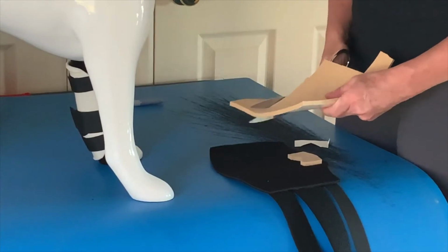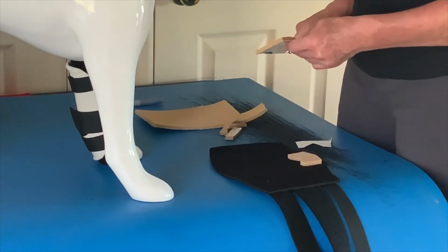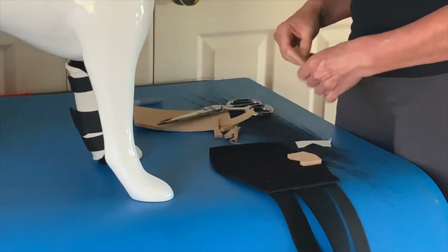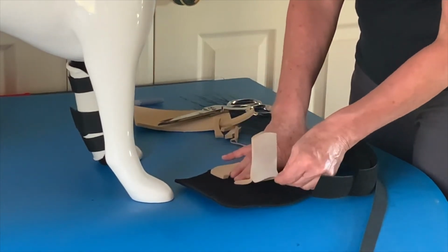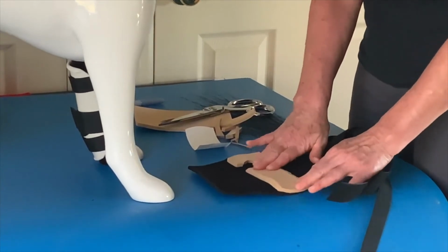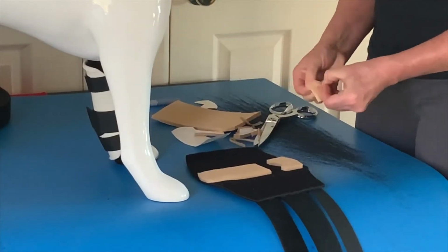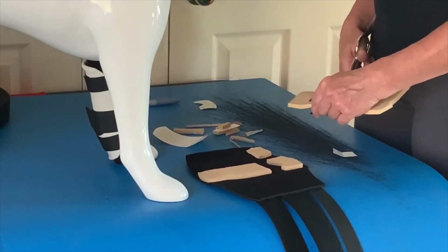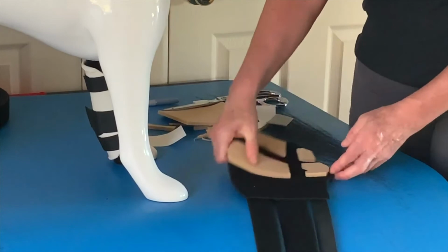Then add another piece of padding along the center trough, just above the carpal pad. I also like to add padding along the medial cranial edge. And it's always a good idea to leave a gap for the dew claw.